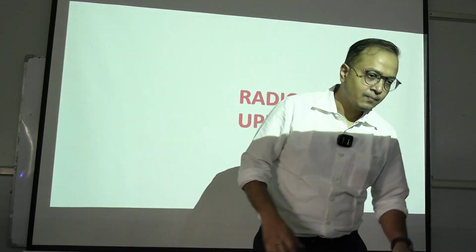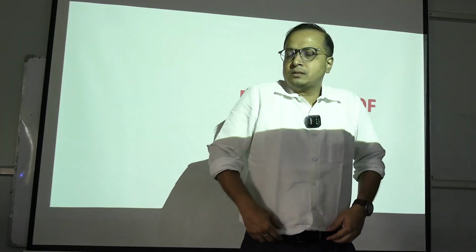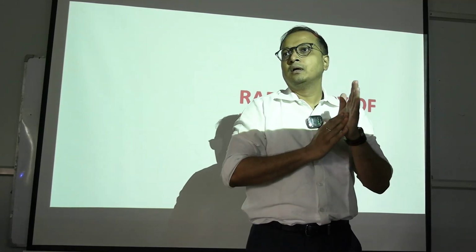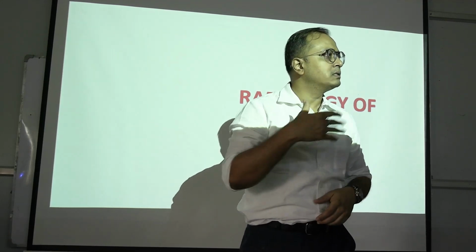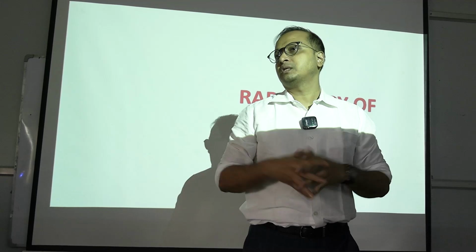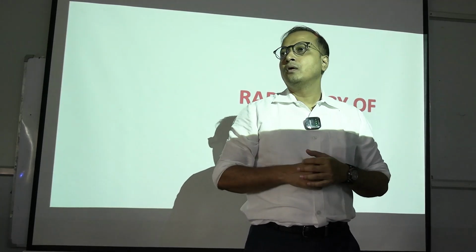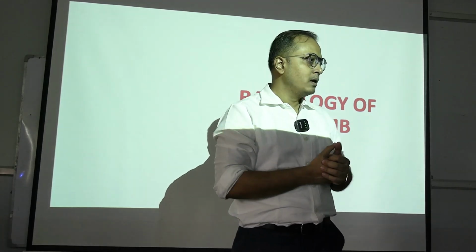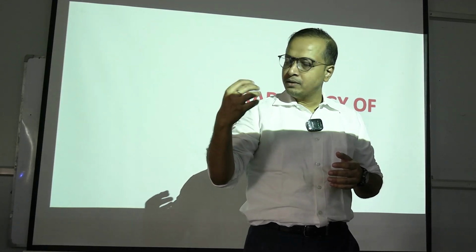Now, once you see these X-ray plates, for undergraduates they are normally of two types. There are general X-ray plates, which we call plain X-ray plates, and the other one is special X-ray plates. Now, what do we mean by general X-ray plates and what do we mean by special X-ray plates? In a plain or general X-ray plate, these particles are thrown at us and they are penetrating our body. So, these X-ray particles are penetrating my body.